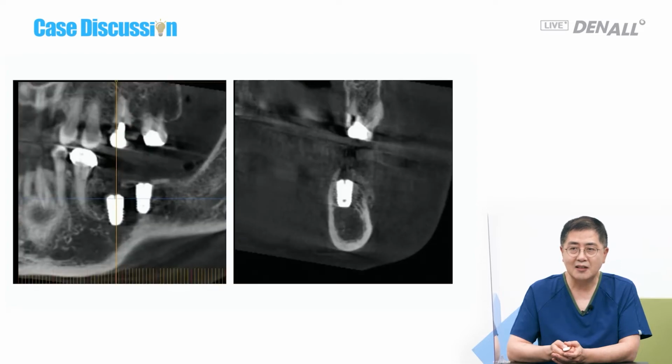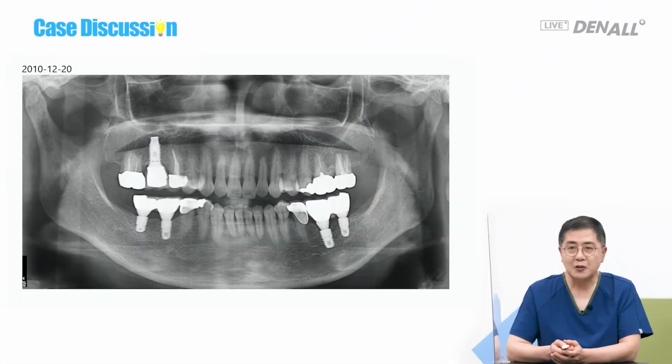At that moment, I was really nervous, and I called several colleagues to come and help me, but they couldn't come as it was in the evening. I courageously drilled into the cortical bone and lifted up. It was my first case to drop the implant in the mandible, and I became more careful afterwards.